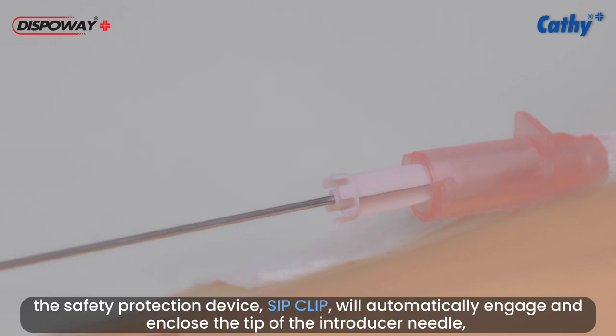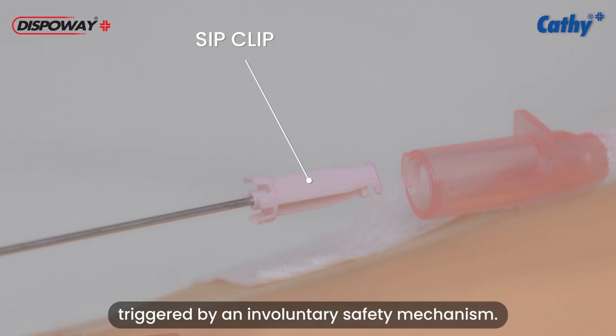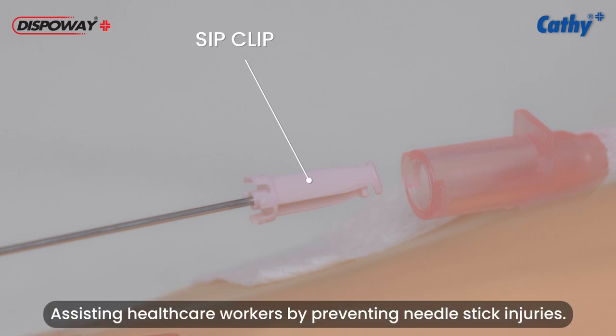When withdrawing the needle, the safety protection device, SIP-CLIP, will automatically engage and enclose the tip of the introducer needle, triggered by an involuntary safety mechanism, assisting healthcare workers by preventing needle stick injuries.